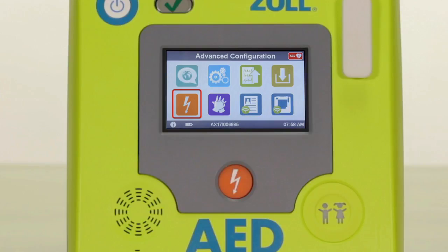The orange shock icon allows you to select the energy setting for the first, second, and third shock for both adult and pediatric patients. This allows you to set the shock energy based on your specific protocols. This feature is for medically trained, more advanced users, and it is recommended that you do not change the factory default settings unless you are qualified to do so.